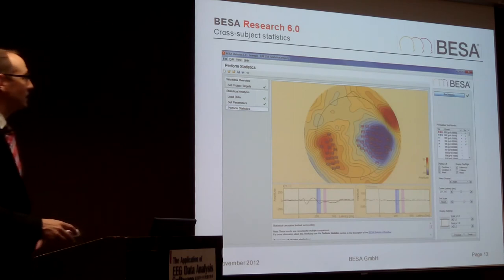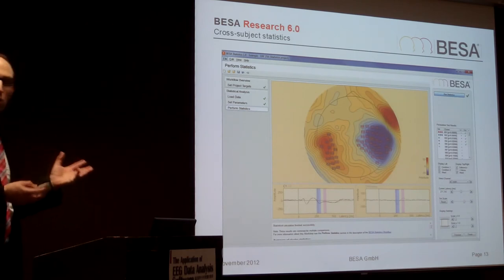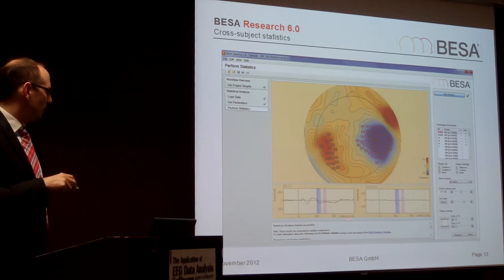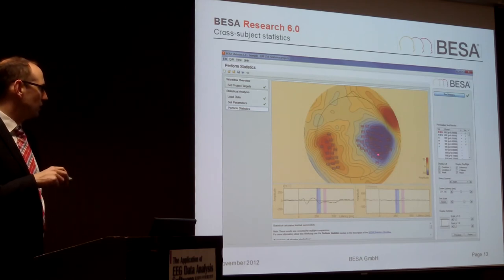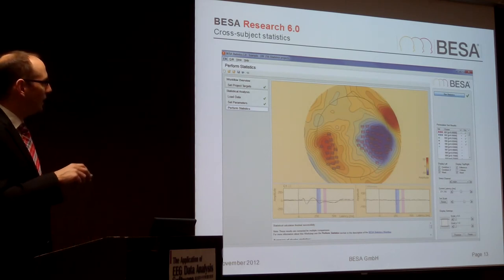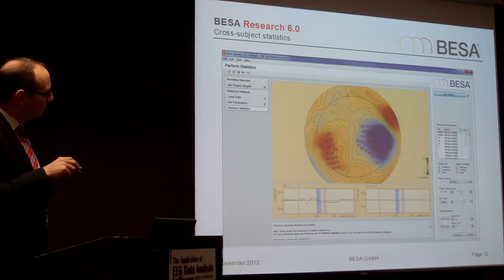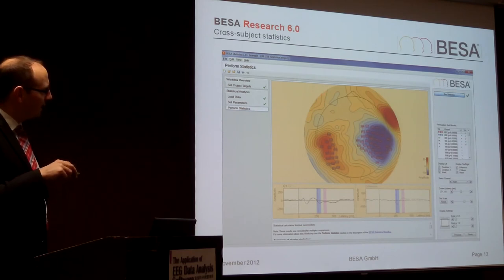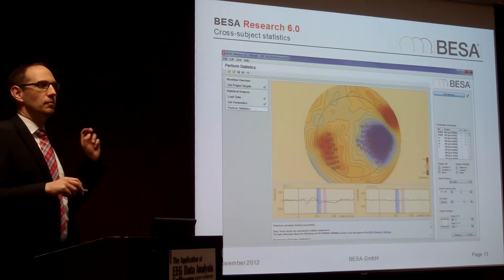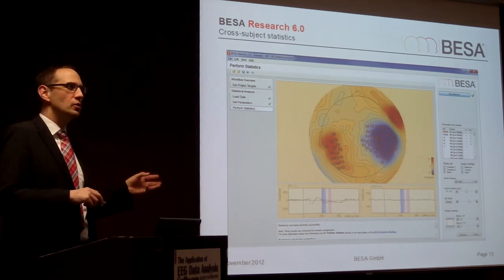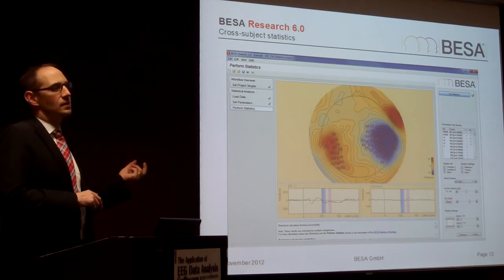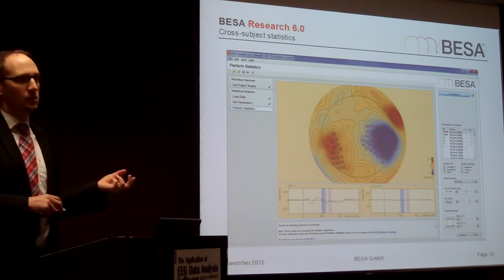That's the basic statistics, rounding up the loop. In the end you have the possibility to calculate cross-subject statistics, and you can export all of this data and directly paste it into Word or whatever software you use to prepare your publication. These nice pictures can then be used in the publication.